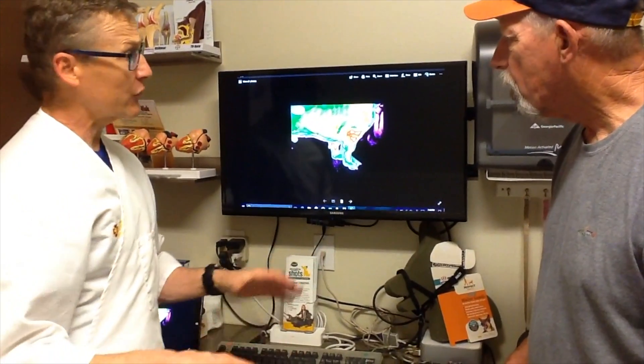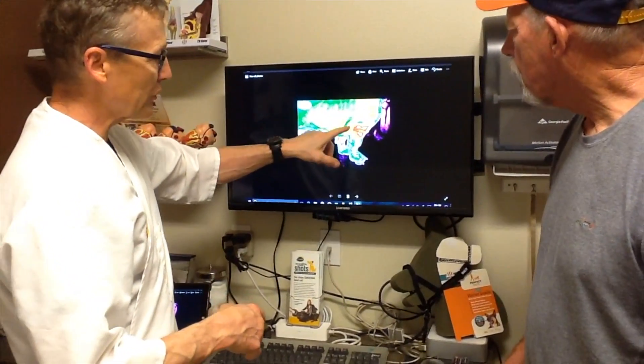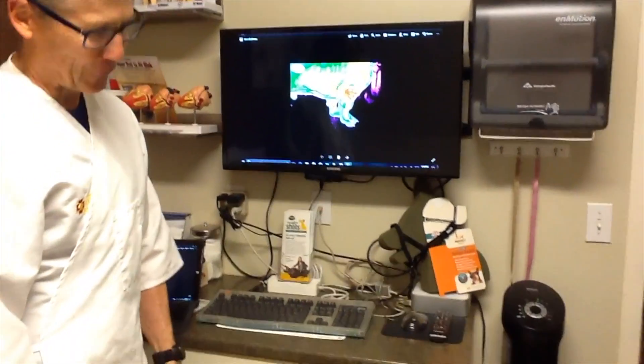In a dog like him that's not showing the lameness very much, it's really helpful to narrow down whether it's the shoulder, the elbow, or the wrist — because otherwise you might assume the problem is higher up in the leg.